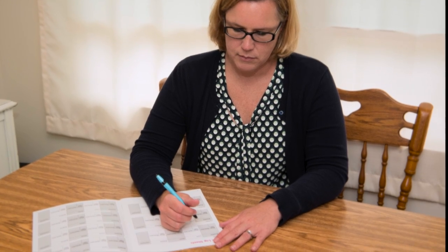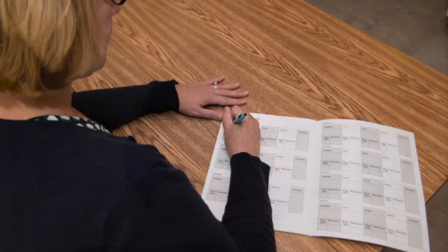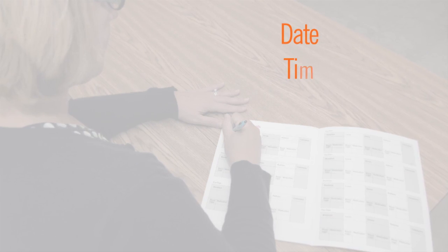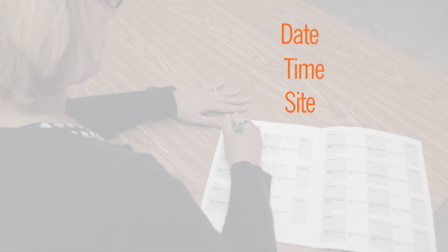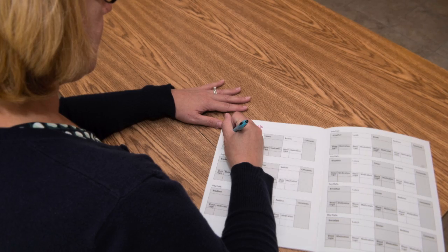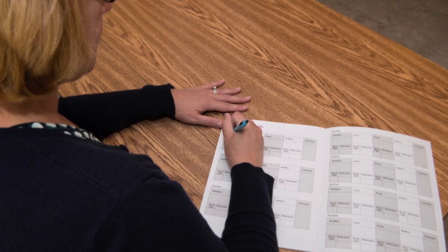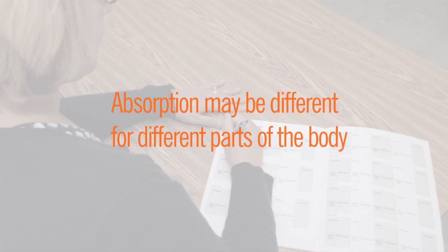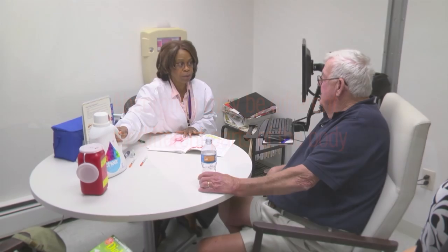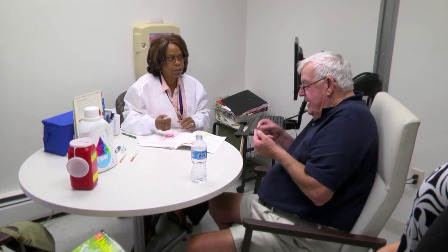Keep a record of which injection sites you have used. Every time you give yourself an injection, write down the date, time, and site. Please note that depending on which type of insulin you are taking, absorption may be different for different parts of the body. Talk to your health care provider to learn more about the insulin you are using and which sites work best.